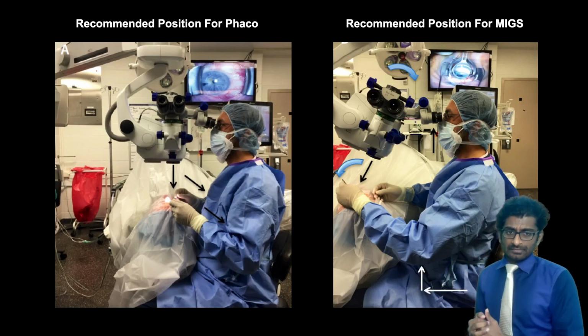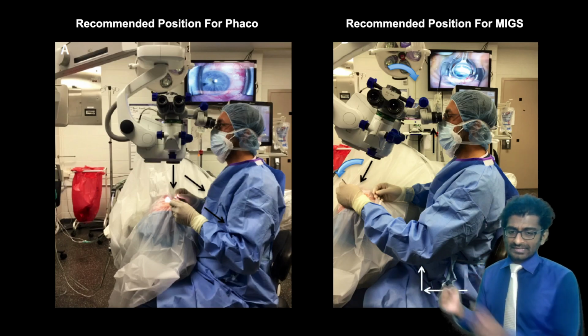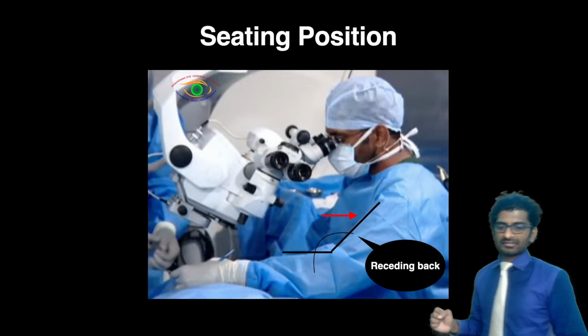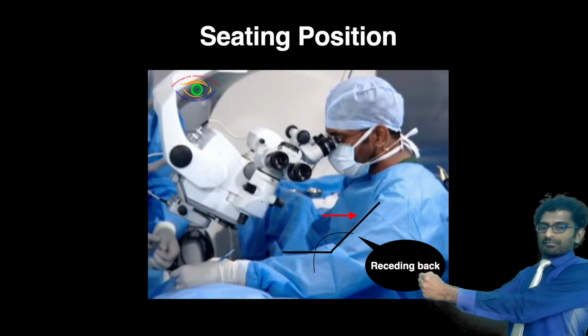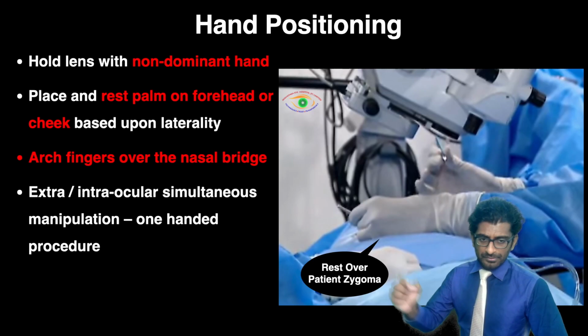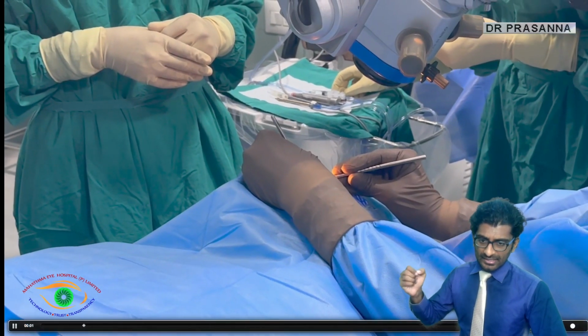So this is a recommended position for phaco that you can see to your left hand side. On the right hand side, you can see a more obtuse angle. With MIGS, you need to recline back and there is a more obtuse angle that you need to generate. Your left hand should be positioned well over the zygoma, and there is an apt positioning because your left hand is as critical as your right hand.